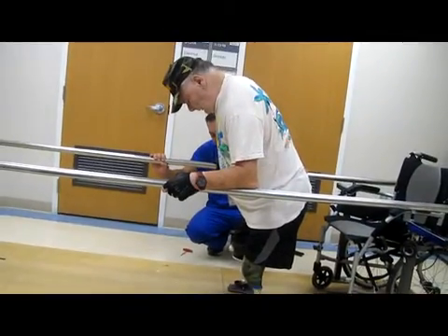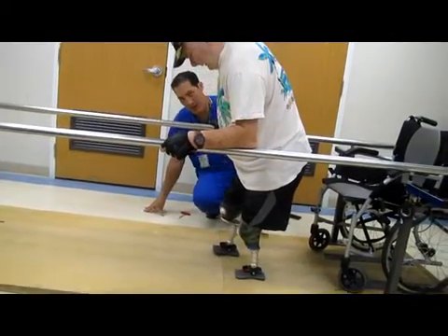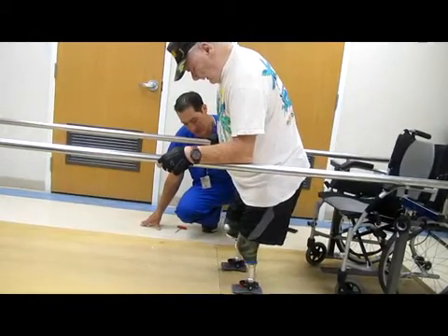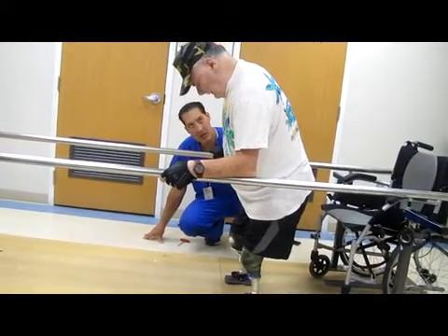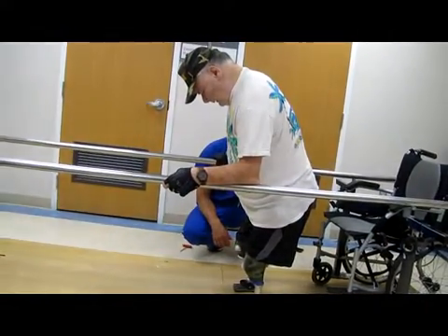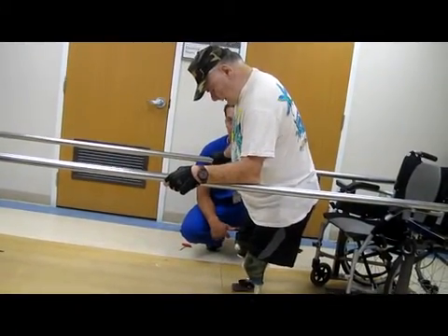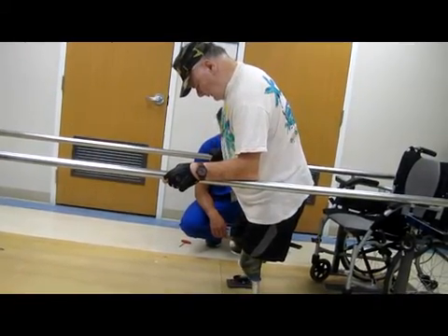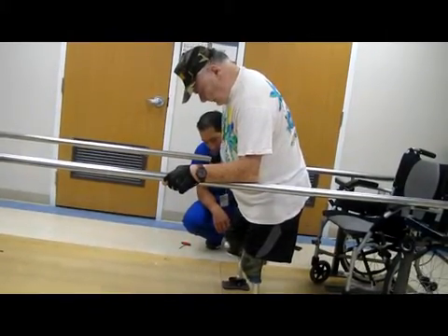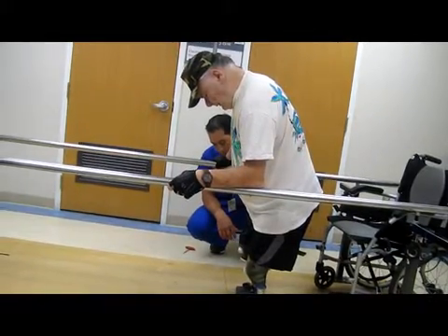Okay. If you get too much pain to where you feel like you've got to stop, open the chair up behind you. If I advance it, of course, I've got it on the heel, huh? You can see it's on the heel here even. But there's some articulation in that foot, so when you put weight on it, the foot should come flat. It should come down if you really weight it, but if you're using your arms. Okay, I see what you mean. I'm purposely putting weight on it now. It's come down. That's what those urethane bumpers are doing.